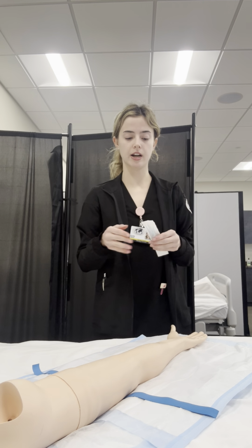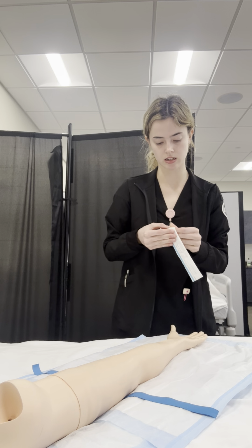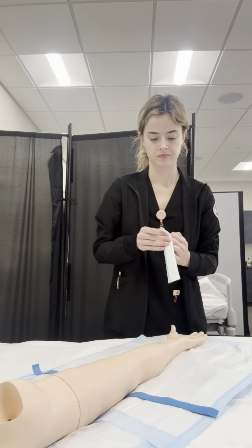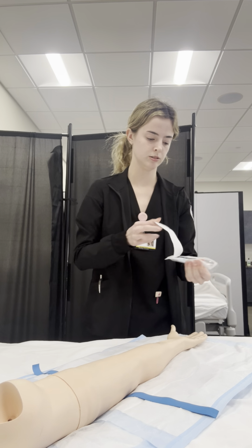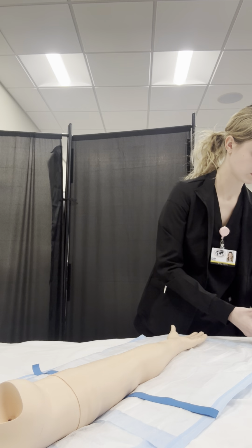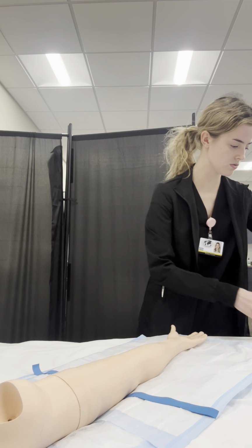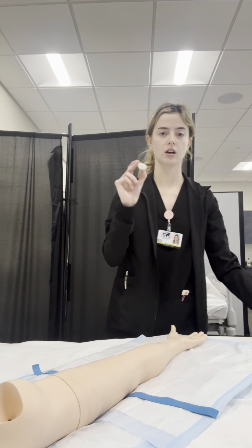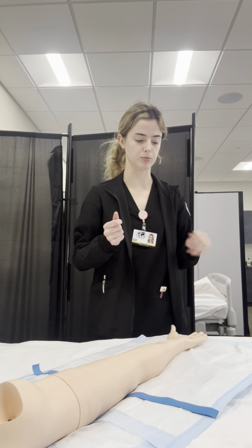Okay, so now that that's ready, I want to go ahead and get everything else laid out because we're about to cleanse the site. So I'm going to get my needle catheter. Lay that out on my table. To clean my gloves and my tubing.